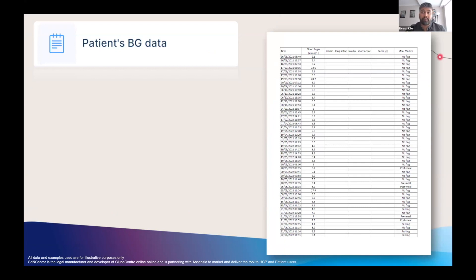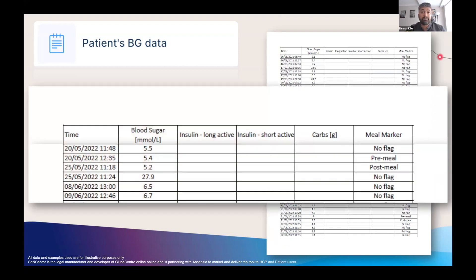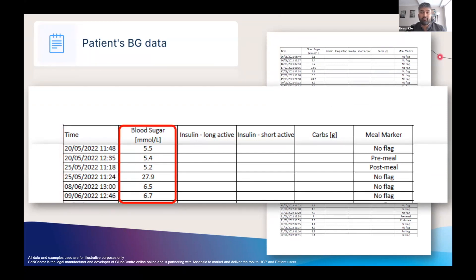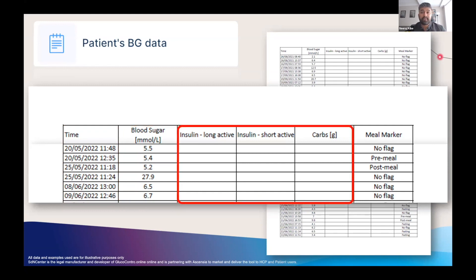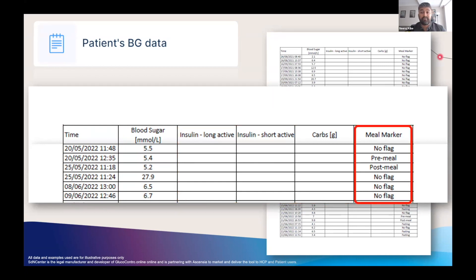The fifth report available is the patient's blood glucose data. This is an Excel-friendly formatted raw data file which gives flexibility to work with the data in a number of ways. The data contains the date and time for each reading, the actual reading value, insulin and carbs if entered via the Contour Diabetes app, and the meal markers if flagged.